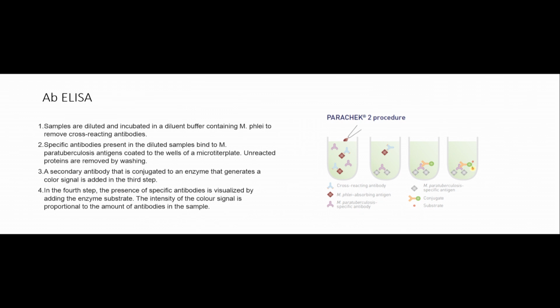I'm not going to go through the test on the side because time is ticking away from me, so I'll skip over that slide. What we did do is work out the parameters, which is the sensitivity and specificity. And I've got a fairly mixed audience. I think people often rattle through quite quickly what these are, but the sensitivity is really the proportion of animals that have got the disease that give a positive test. And the specificity is the proportion of the animals that don't have the disease that give a negative test.